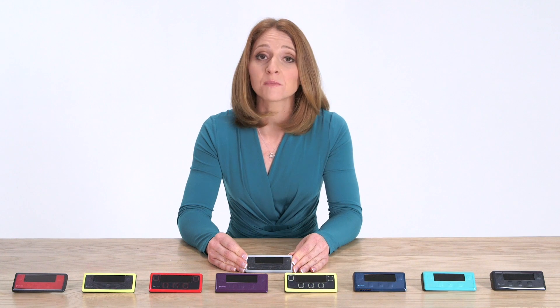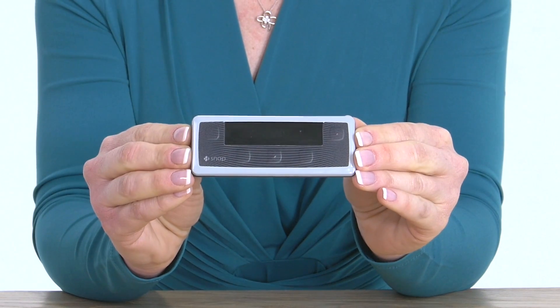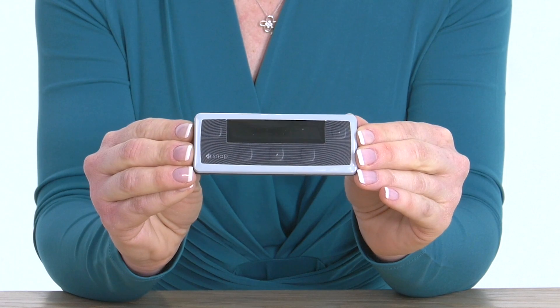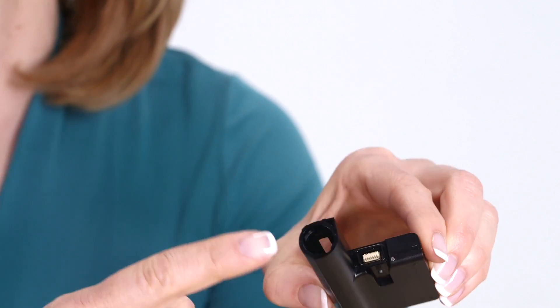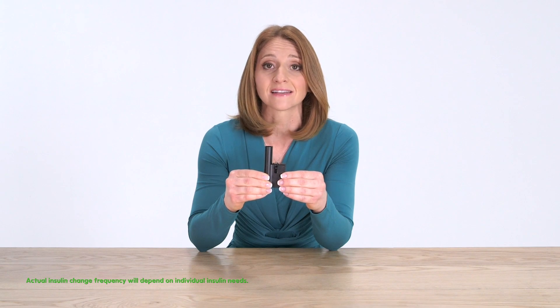I'm going to show you a few of the pieces that you'll need for the setup of your SNAP. This is the controller, which houses the electronics of the pump — or what I refer to as the brains of the pump. This piece here is called the pump body. It contains all the moving parts that will deliver insulin through the tubing. It is designed to last up to one week and it houses a pre-filled insulin cartridge.